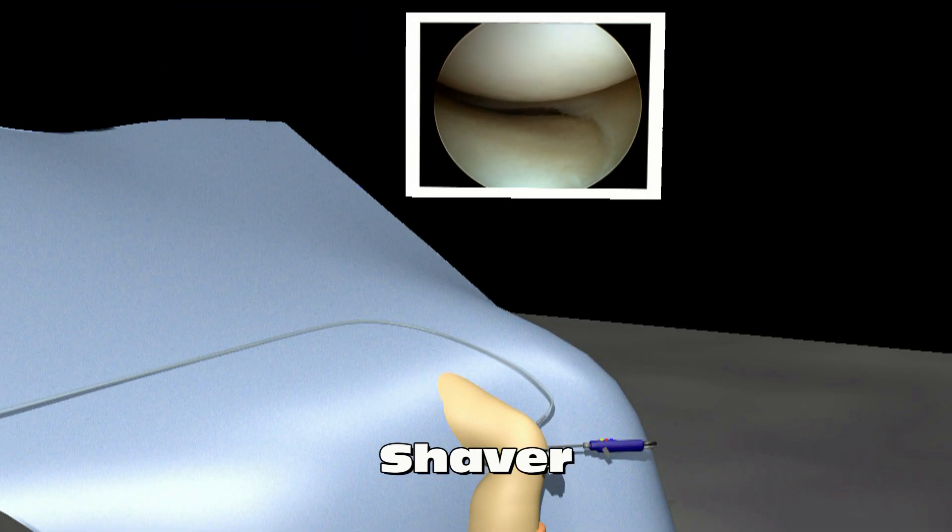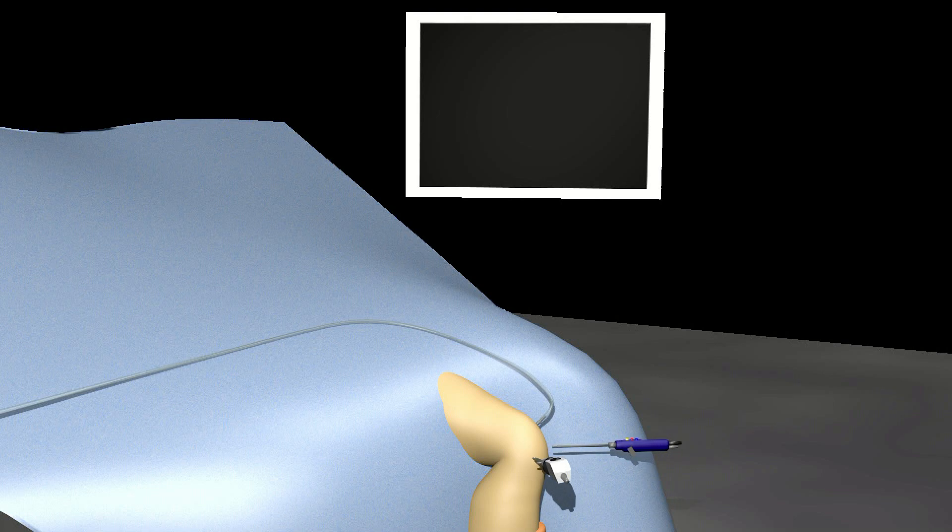When the procedure is finished, the instruments are removed. Sometimes the portal sites are closed with stitches, but not always. The knee is then dressed with a sterile dressing.